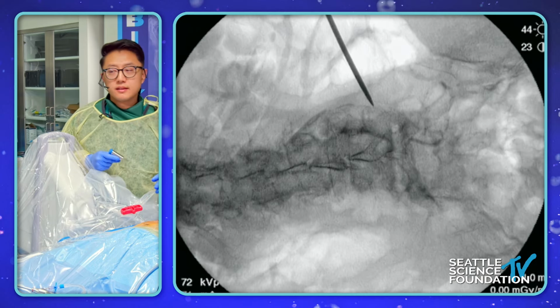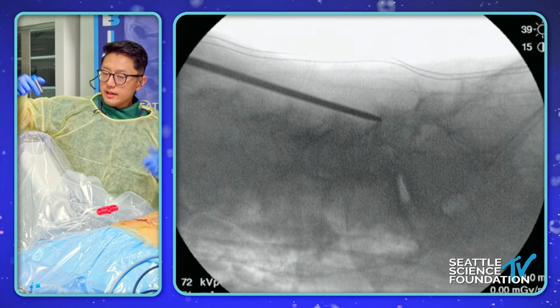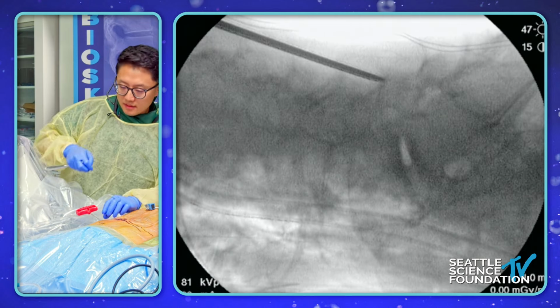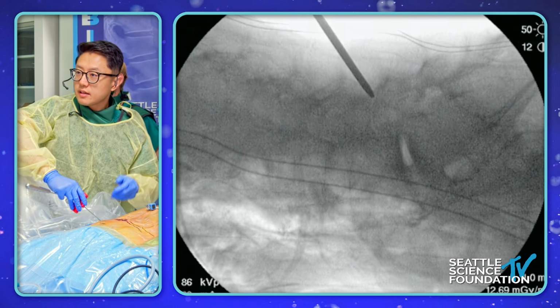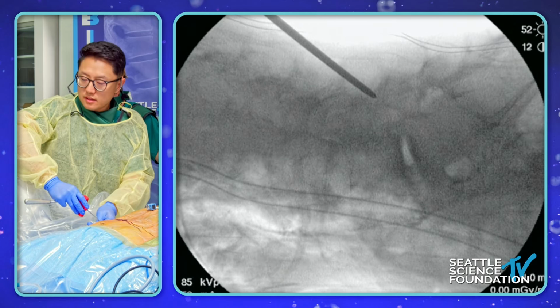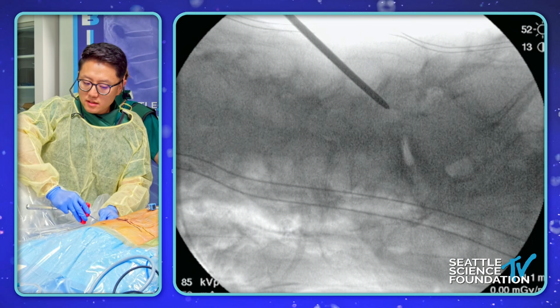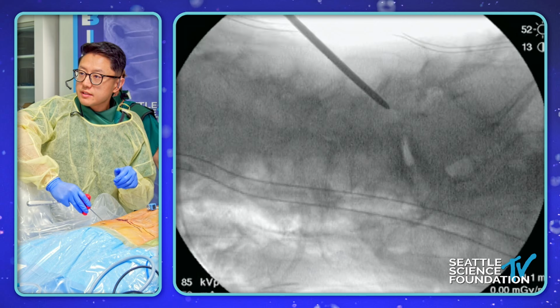And I think the take-home point is, you can't settle for parallax imaging. And I think bring the machine down a little bit. The struggle here is that this significant scoliosis specimen is challenging to do without having a table that we can rotate. Let's see a shot there. But now you can see the SAP, right? A little better. Shot there. One more. This is our shot. SAP right here, and he's essentially docking. You can see a little bit of the pathology. Can we lighten up the contrast maybe a little bit on the X-ray image? One more shot there.